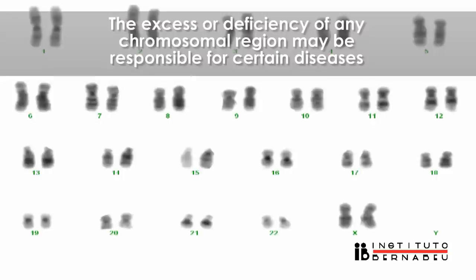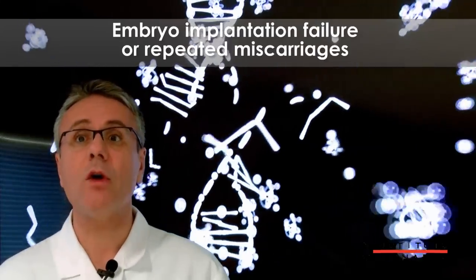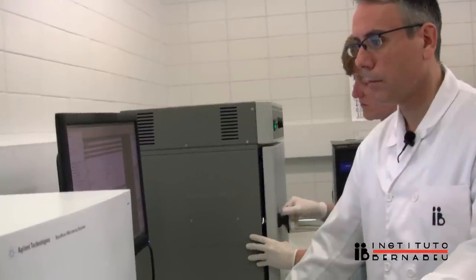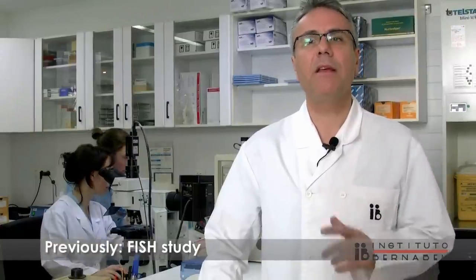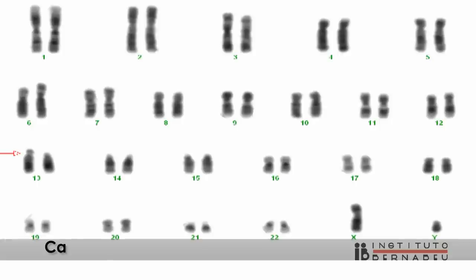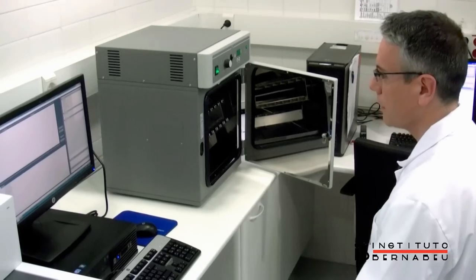The excess or defect of any chromosome region may be responsible for certain diseases or fertility problems, such as implantation failure or recurrent miscarriages. Until now, the possibility of analyzing our genome was very limited. There were essentially two most commonly used techniques. FISH. The use of fluorescent probes allows us to analyze the presence or absence of a single chromosomal region. And the karyotype, which reveals the number and structure of the chromosomes.